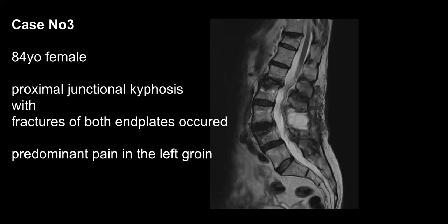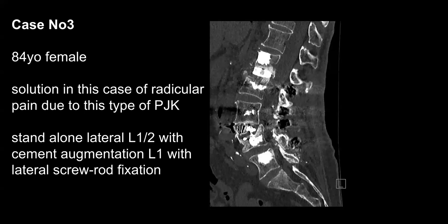This is maybe unusual for you, but I did a lateral approach again, like in the last case, but it was a stand-alone lateral procedure. I inserted the cage as usual and did the excision of the disc as usual. Of course, I felt it was a little bit soft, but it's only soft in the middle of the lateral, where the end plates are. The apophyseal region was pretty good.